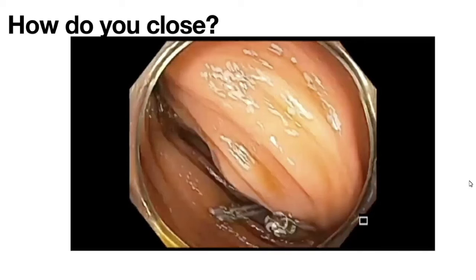How about you? We usually use just a syringe flush, so we don't use panchromoendoscopy much. But I read the literature about the method, put the indigo into a pump. I think it's a very useful, easy technique. When you say syringe pump, is it a syringe attached to the biopsy port and flushing? No, just a syringe flush. Without a catheter? No. Without a catheter, okay.